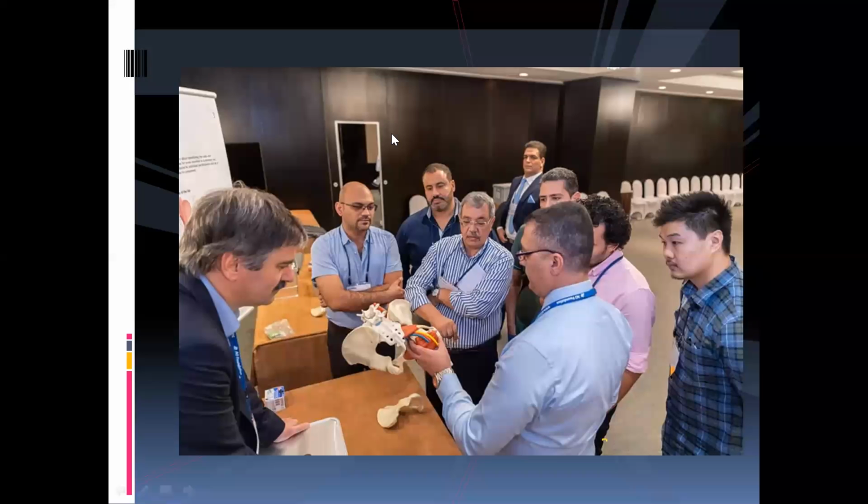Dr. Hussein Zofi asked about the divergence of the cup. As you see, the native acetabular shell must be an open mouth. In cases of protrusio, there will be an overhang over the femoral head and neck, so when you resect the neck, you cannot have it much opened.